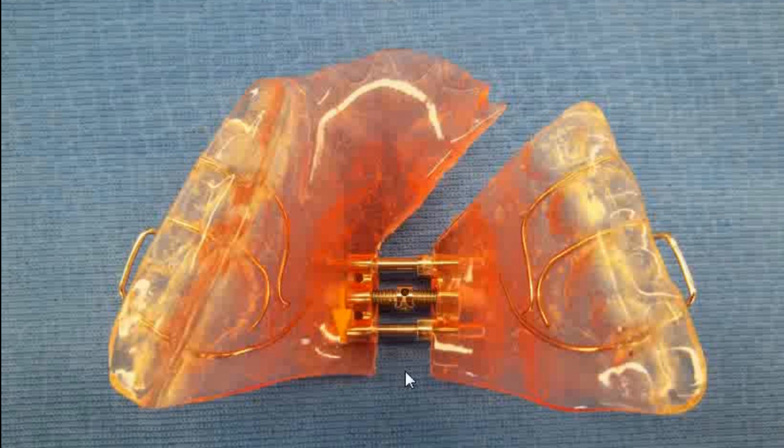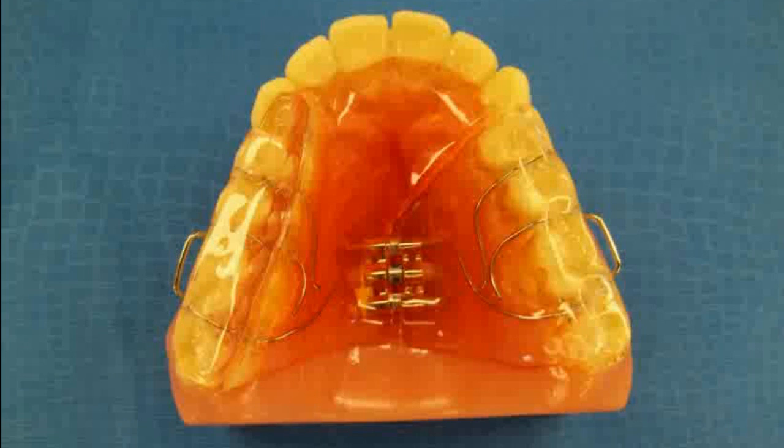Once the expansion is completed, you can switch to a fixed lingual appliance such as a 3D multi-action expander. This appliance will hold your expansion as you begin straight wire treatment. You can also activate this fixed appliance to expand the arch more if you need more development. Some doctors will leave this lingual appliance in place for the entire treatment to prevent any relapse from occurring.